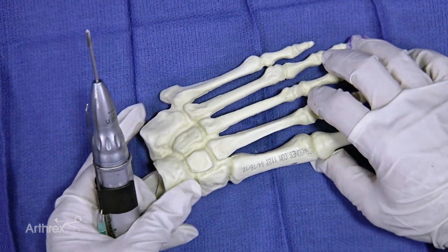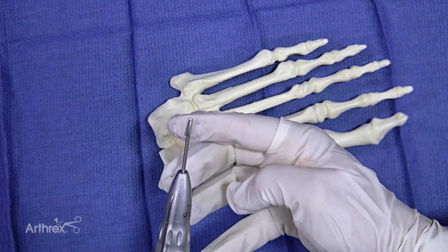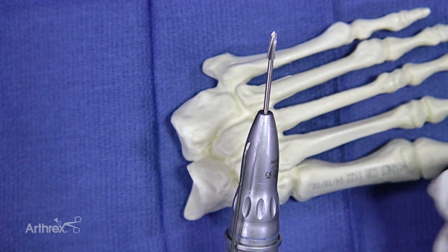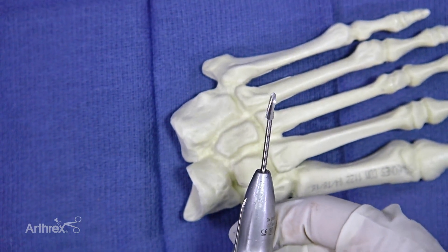The burr we're using is a little bit different burr. It's a wedge burr and it's designed for basically shaving the bone.